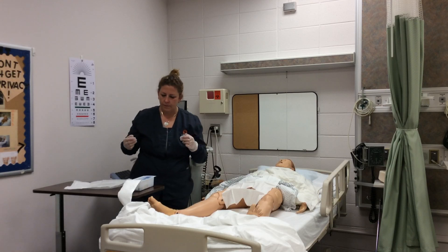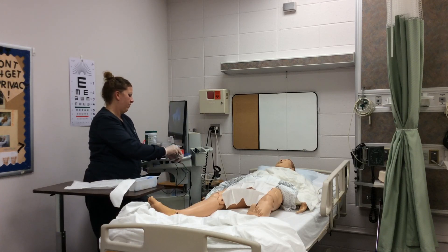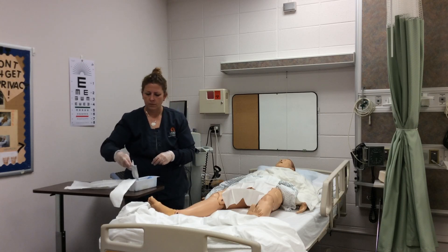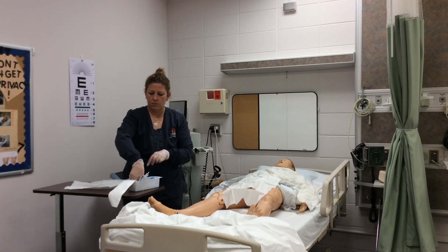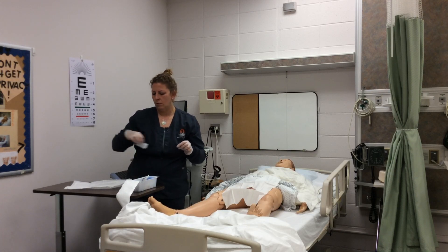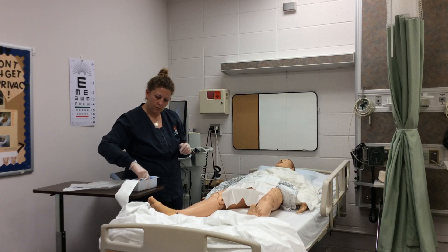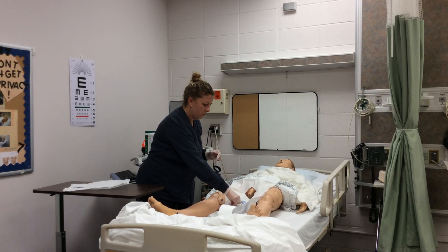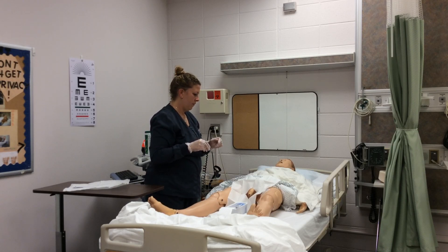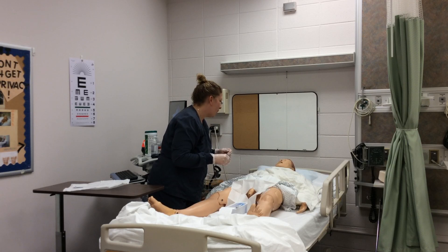She opens the packet of antiseptic swabs and prepares the lubricant. She places the kit close to the patient by placing her gloved hand inside the tray to maintain sterility during the transfer. She advises the patient she will be touching him, indicating where, and communicates throughout the procedure: 'I'm going to hold your penis and it will be cleaned with some cold antiseptic swabs now.'